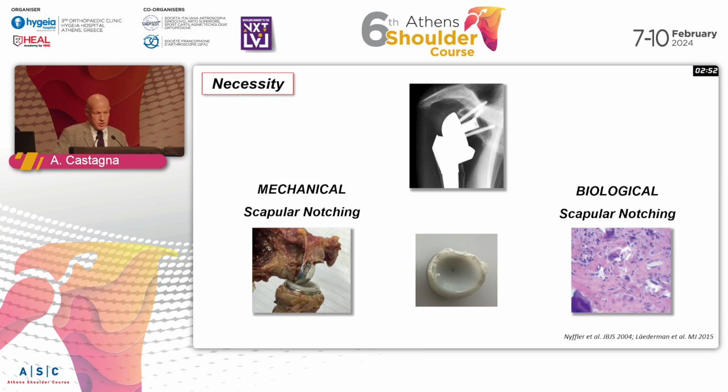And lateralization was a good result for the mechanical thing, but still we have the biological, that is the scapular notching related to the poly wear. It is different. You have a mechanical notching, you have a biological notching. And still here we are working.